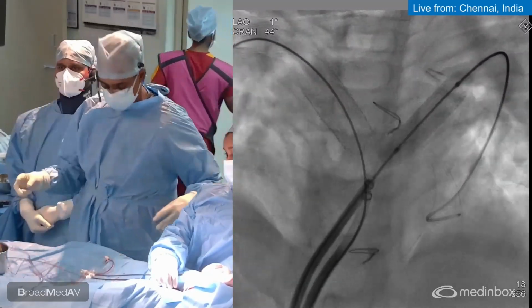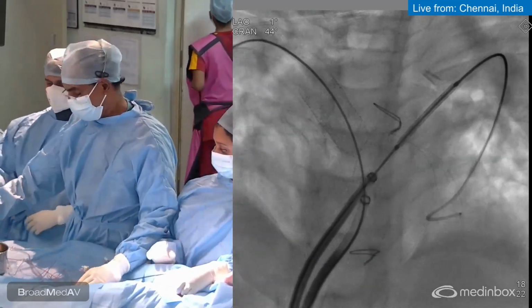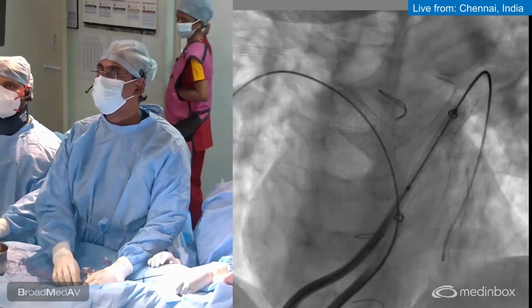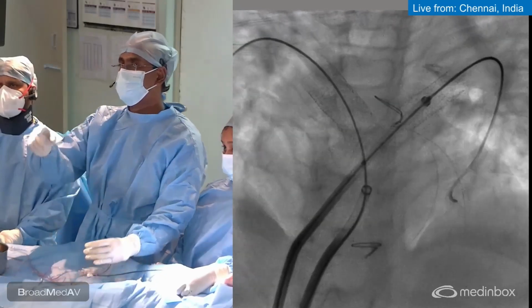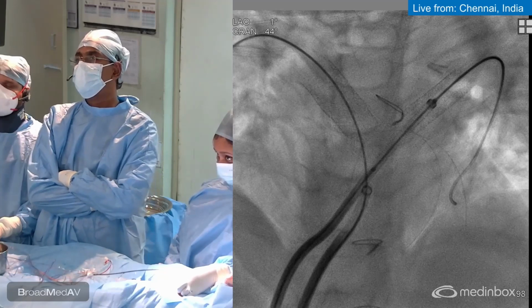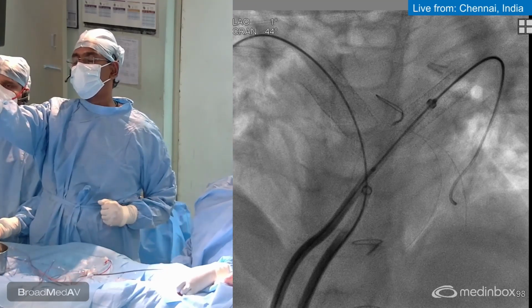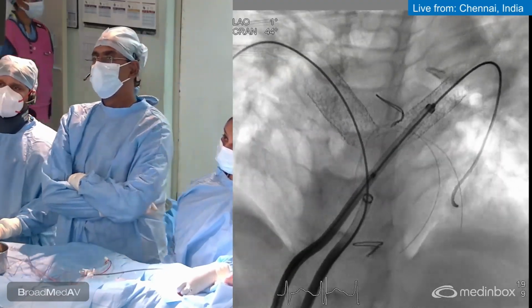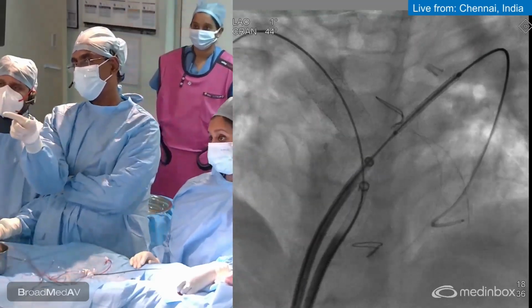So at this point, the stent is actually flush with the other pulmonary artery. So can you hold the wire? Is this balloon fully negative? Fully negative. Okay. No, it is possibly there only. No, approximately it has moved more distally. More distally. You see that? The previous picture you showed? Not here, the previous one.